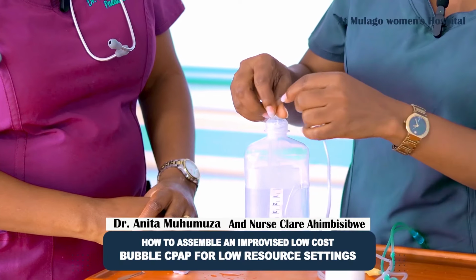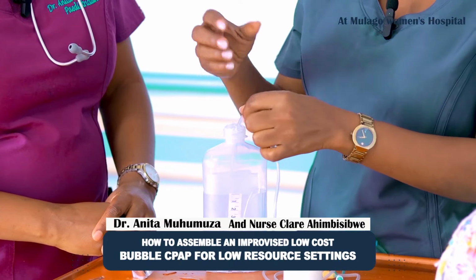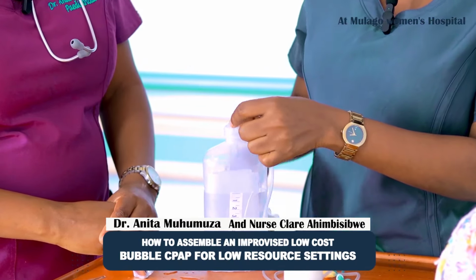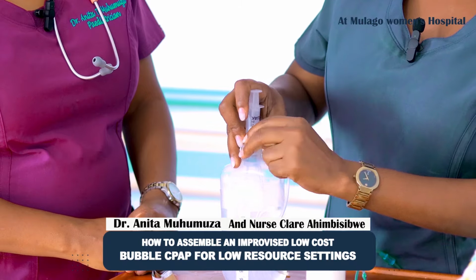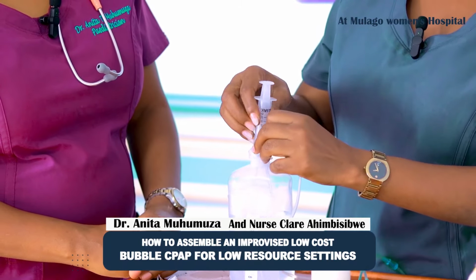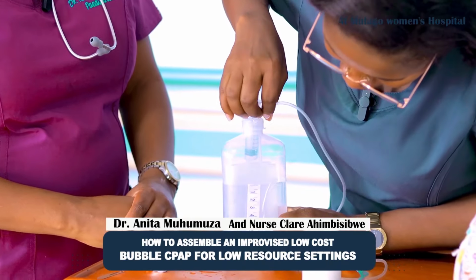For the case of our baby, we set it at 5 because that's the minimum PEEP that we need to be maintained in the alveoli. But for other babies, they might require a higher PEEP. So we secure this tube with our syringe. Another thing to note is to make sure that the tube is not compressed so much. So make sure that the syringe is loose and you ensure it's at the 5 centimeters mark.